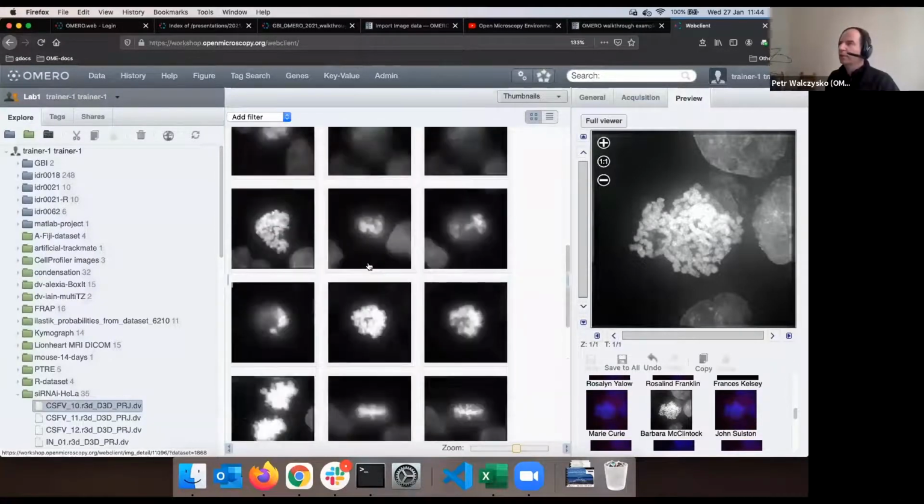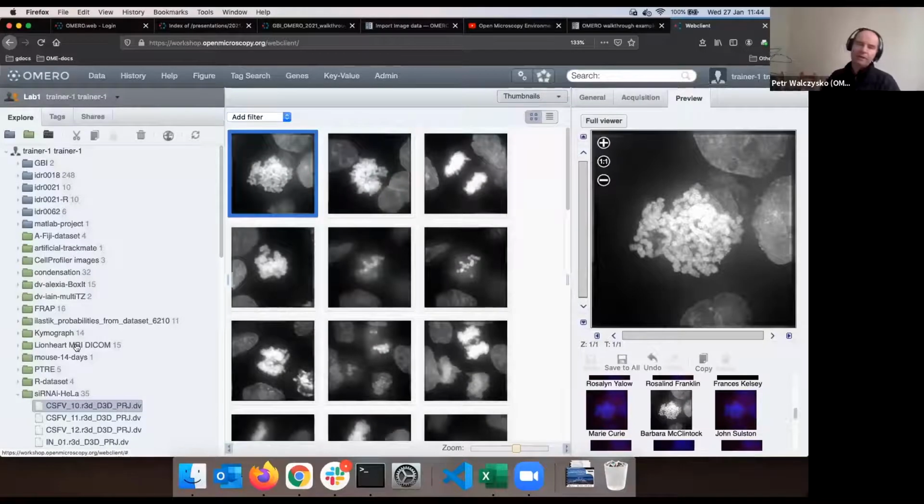Barbara McClintock has her own portfolio of her own images, but this is a duplicate. And if she changes her rendering settings on that, I can't see that. On this image, we all have, let's say, 50 instances of the same images which are independent of each other.